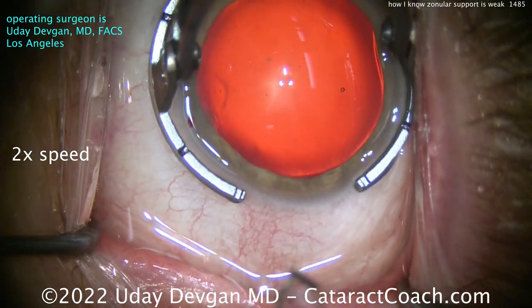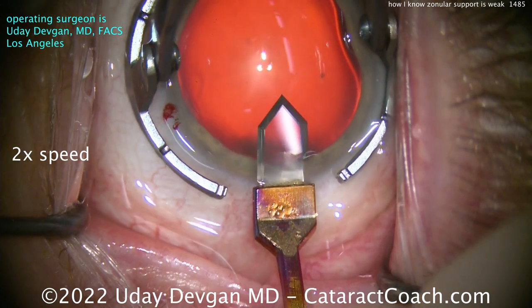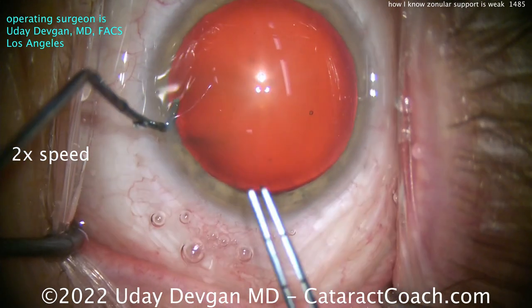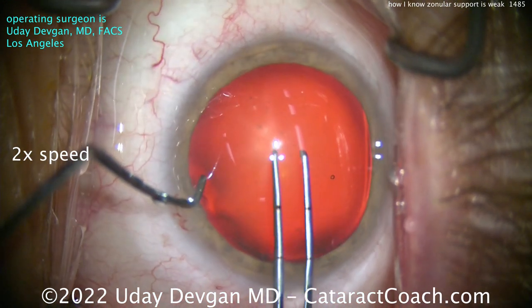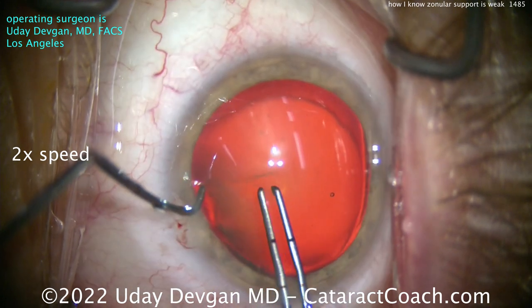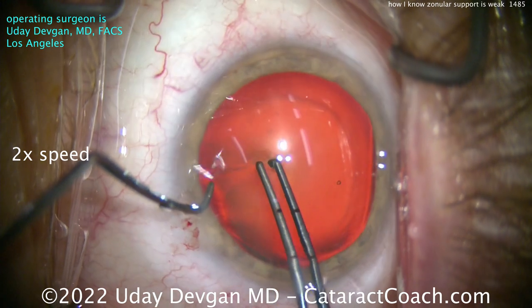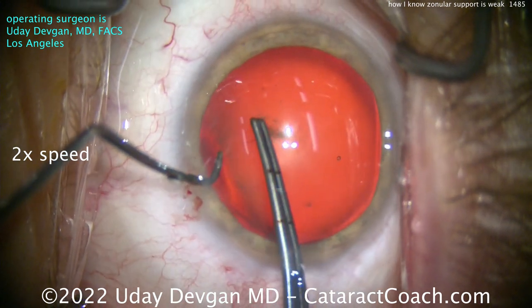I put some viscoelastic in the eye. Let's make our main phaco incision — that all looks normal. Now let's start the rhexis, and here's where we have the big clue. Look how much work it is to try to get this rhexis done. I try to poke into the anterior lens capsule, but the capsule's so loose — look, the whole lens moves. There's a lot of laxity here of the zonules.